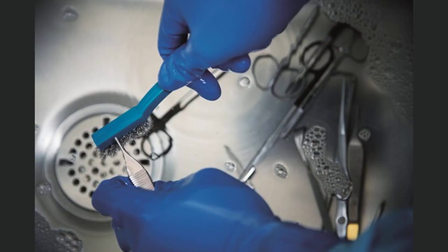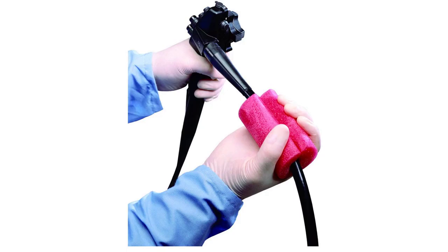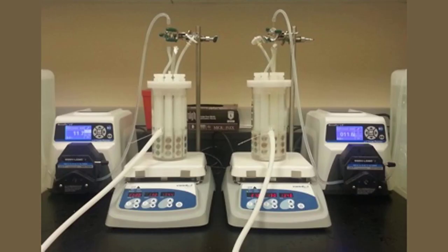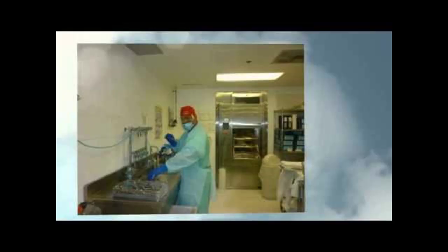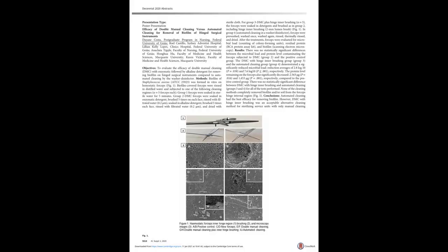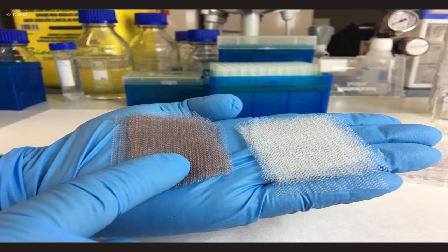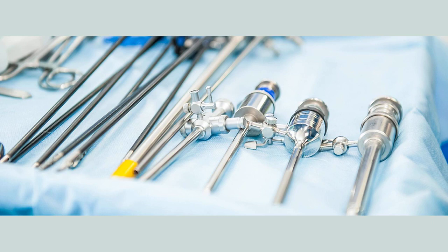Since biofilm is a significant issue, medical professionals have quickly taken action and found promising resolutions. For example, they found silver nanoparticles have anti-biofilm properties that could weaken it. This ingenious approach targets the microorganisms instead of the EPS, giving them a higher chance of success. You can put various chemical treatments on surgical instruments to reduce the chances of biofilm formation. If they slide off instead of sticking, they can't replicate or spread. Solving the problem before it ever begins is a pretty wise approach to an antibiotic-resistant contaminant.